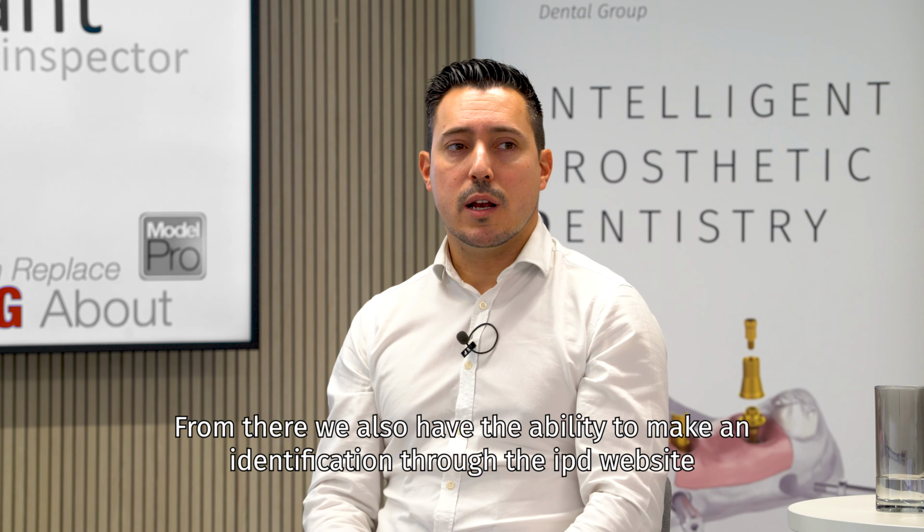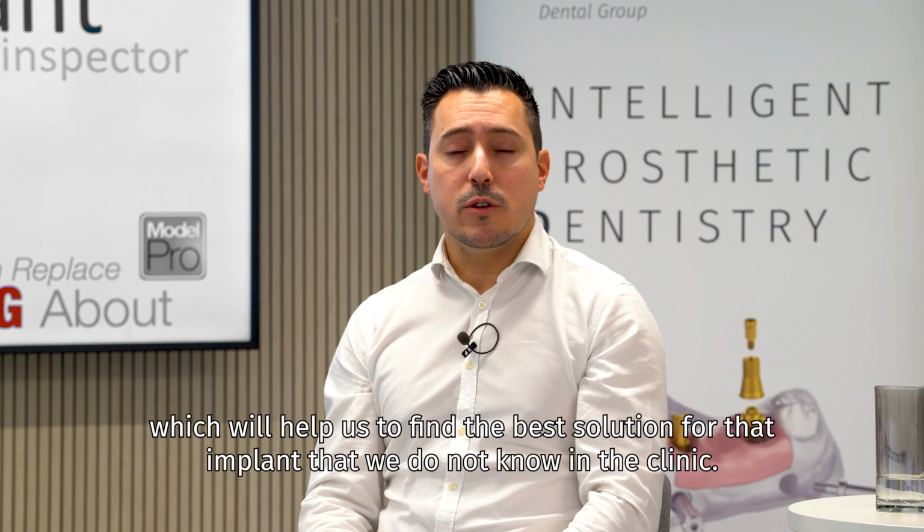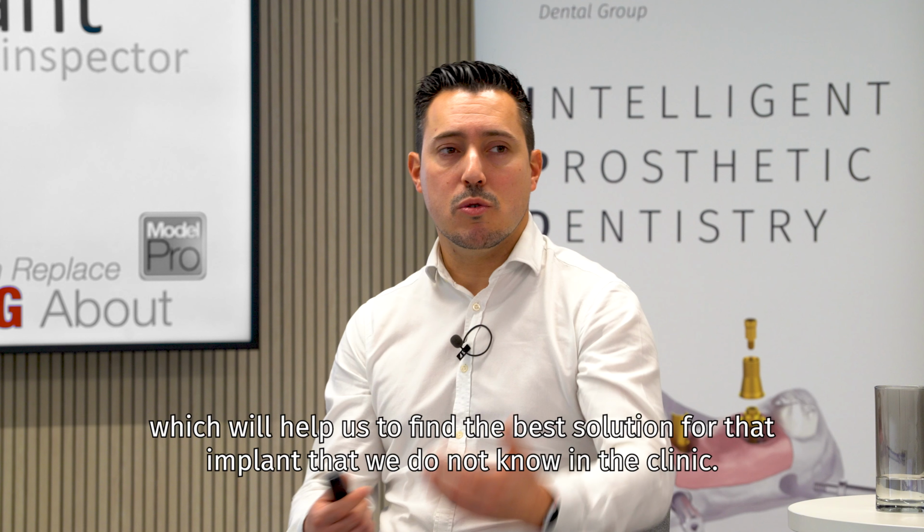From there, we also have the ability to make an identification through the IPD website with its implant identifier, which will help us to find the best solution for that implant that we do not know in the clinic.